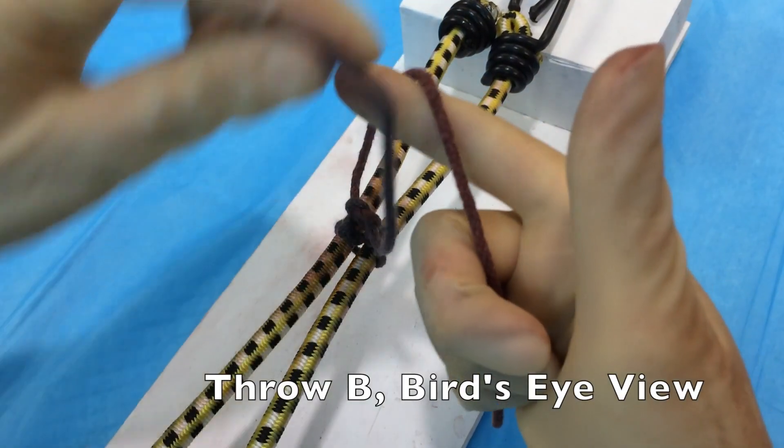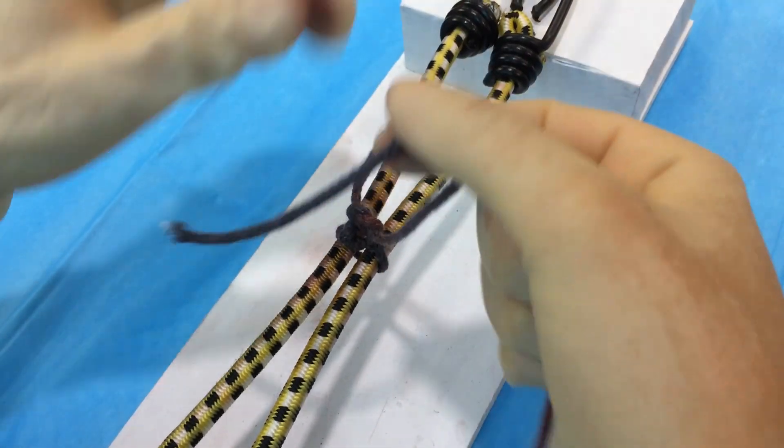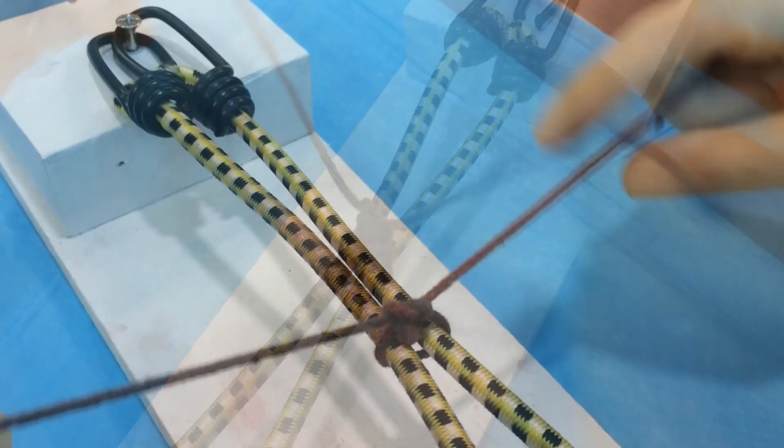Let's take one more look from the bird's eye perspective. Again, we make that pistol position with our right hand, cross our bird's beak through the loop. This time we retrieve the strand and bring it back towards us as we hold the knot flat.